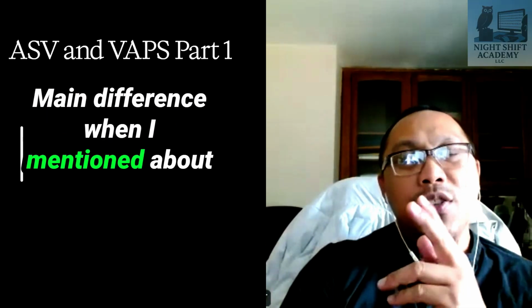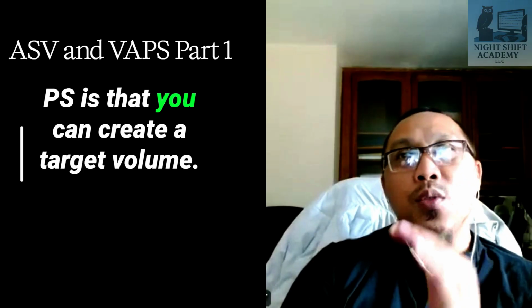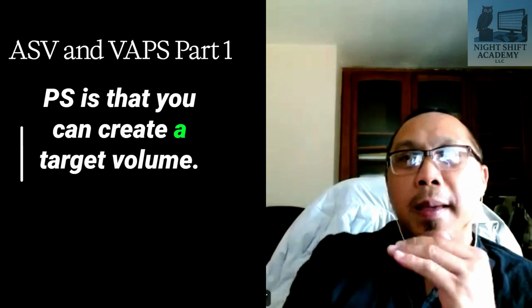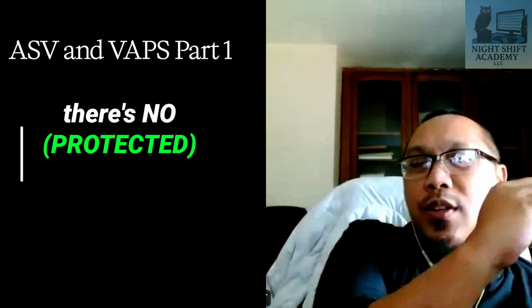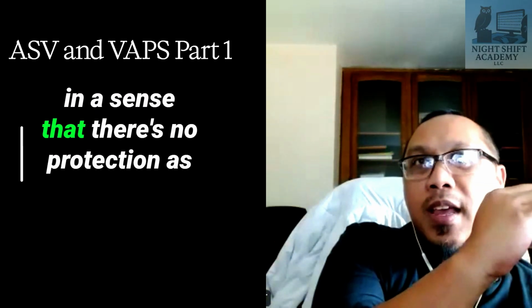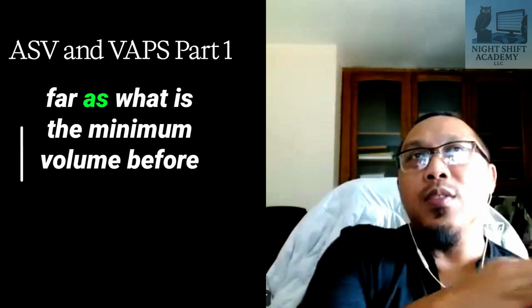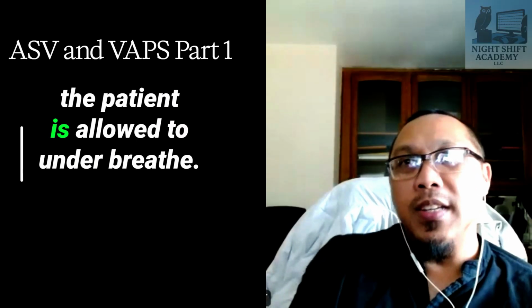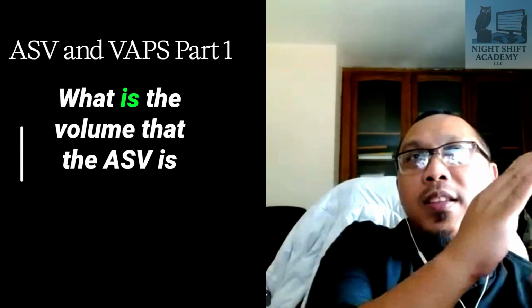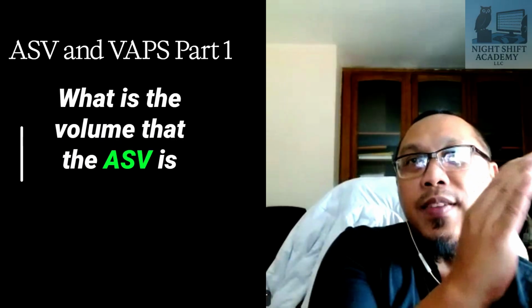Main difference, when I mentioned pressure support, is that you can create a target volume. Meaning, on ASV, there's no target volume, in the sense that there's no protection as far as what is the minimum volume before the patient is allowed to underbreathe. What is the volume that the ASV is protecting?